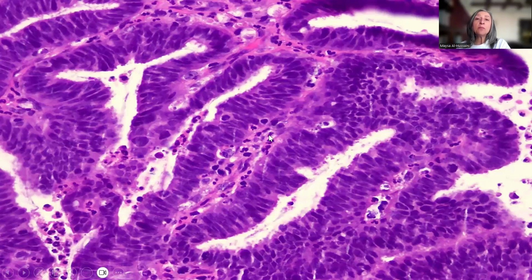Now, on medium power magnification, as you can see, we have this malignant glandular proliferation with cigar-shaped nuclei, stratification, loss of polarity, or features of malignancy. But in addition, there are two features that can help to support the diagnosis that this is HPV associated. And these are basal apoptosis and floating or apical mitosis.